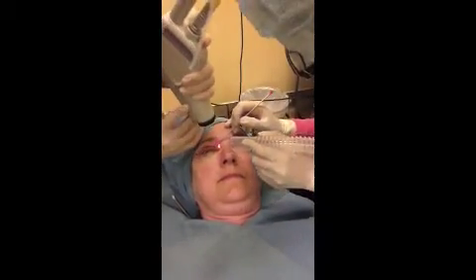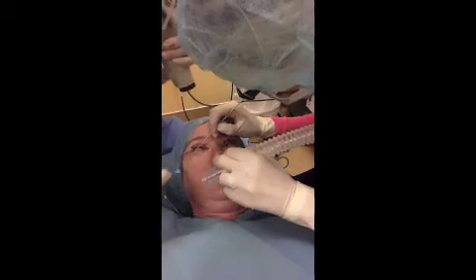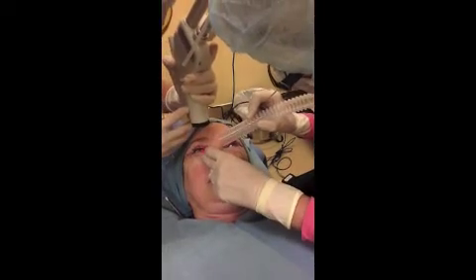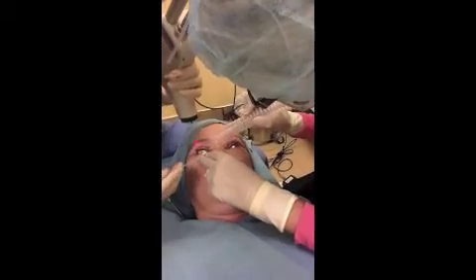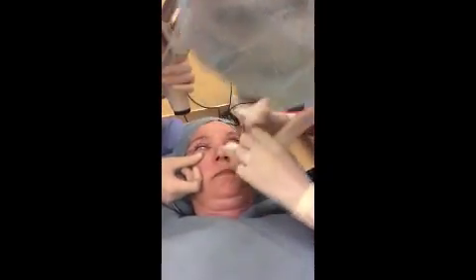And then didn't she have an SP on this side too? Yes, the two under her lash line. So look up — she's got one here and one here. I see it. And then one on the lateral. That one I see. I think it's right here. Oh yeah, right there.